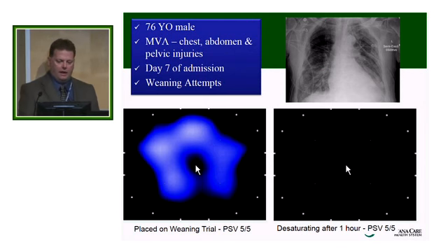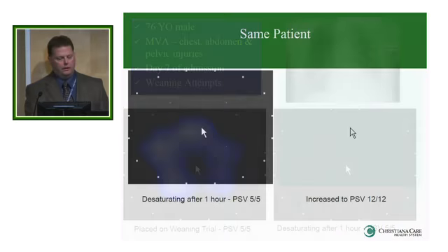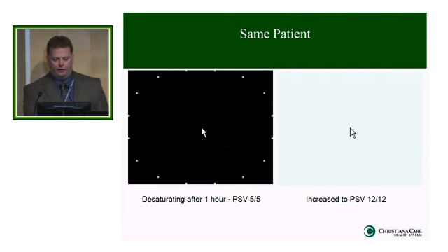Cut to the chase, in the interest of time, we placed a patient on a spontaneous breathing trial, and this is what they look like. So we see really nice ventilation throughout. They were desaturating about an hour into their spontaneous breathing trial, and let's take a look at what we lost.